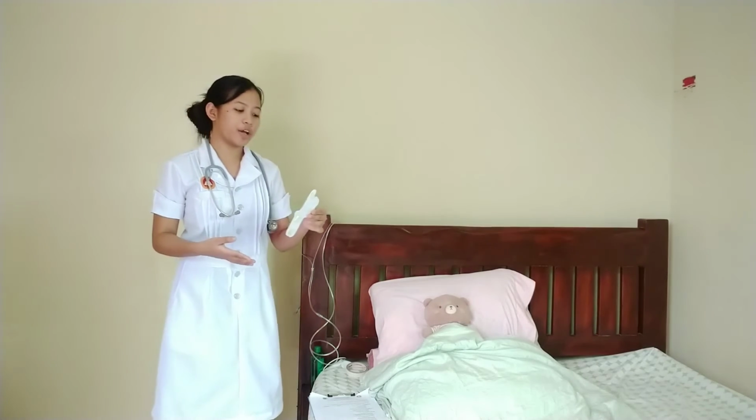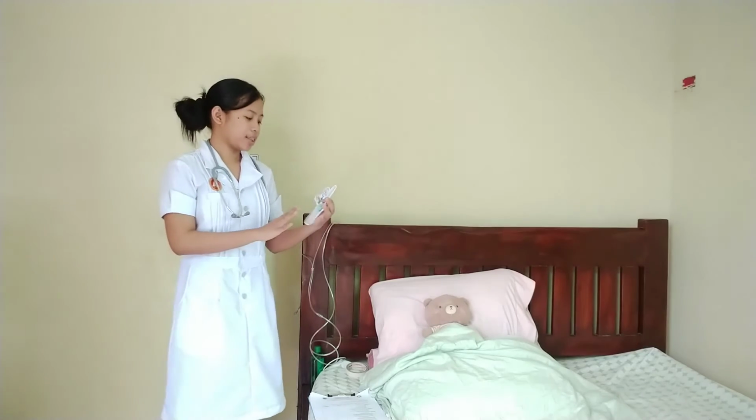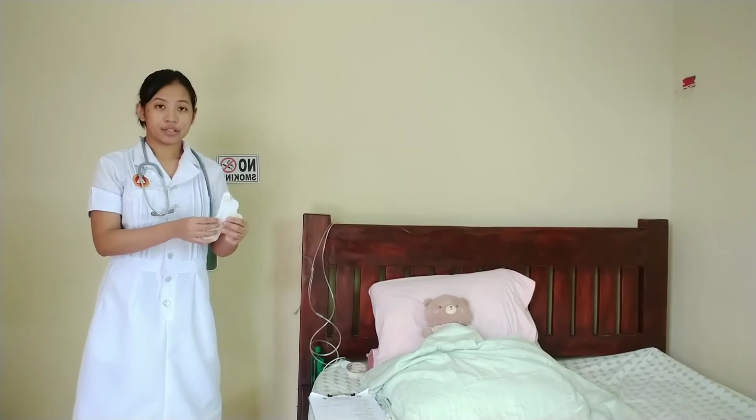And then after that, if needed, I will fill the humidifier bottle with some solution or water. And then I will attach the humidifier bottle at the base of the flow meter, and then I will attach the prescribed oxygen delivery device and the tubing to the humidifier bottle.